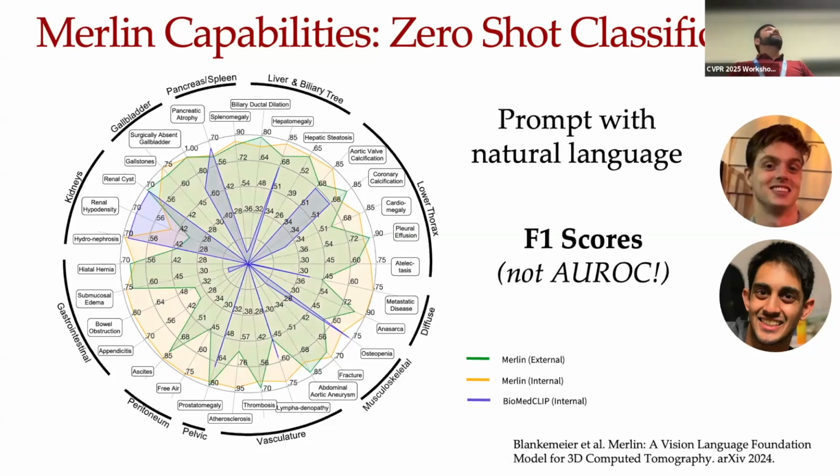And even when we apply this to external data that write radiology reports in a completely different style, have completely different patient populations, we see surprisingly high performance still. So we're quite excited about what the capabilities of some of these models could actually have.